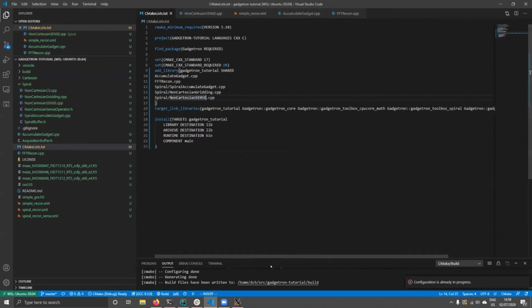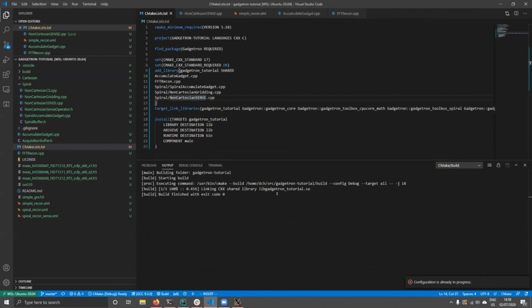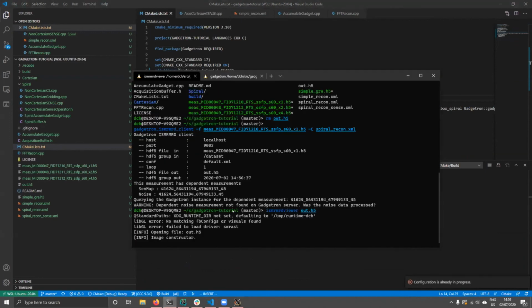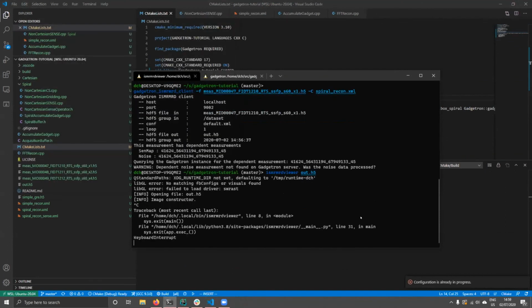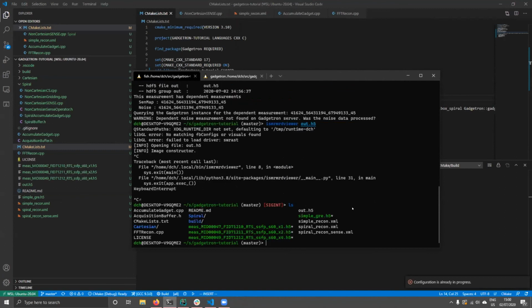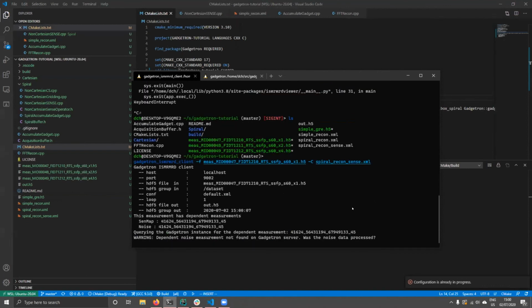We just add the SENSE here. It's built. Brilliant. We need to shut down the viewer. And then we do the SENSE reconstruction. It takes a little bit longer, but not too bad because it only needs to do the pre-processing once and not in every iteration.